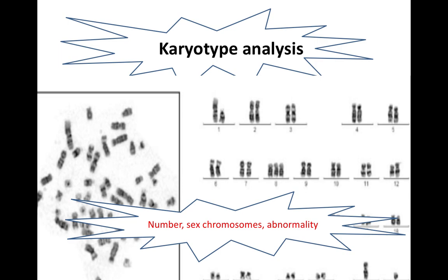This karyotype is described as 47, just by counting, because an extra chromosome is present here, and it's a male, XY, and the type of abnormality which increases the number of chromosomes is plus 8, trisomy 8, comma, the structural abnormality is deletion in chromosome 1, P.